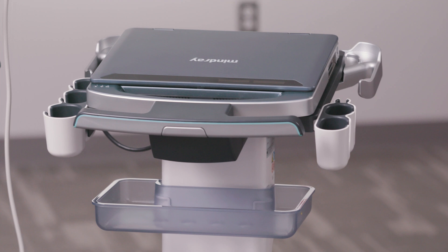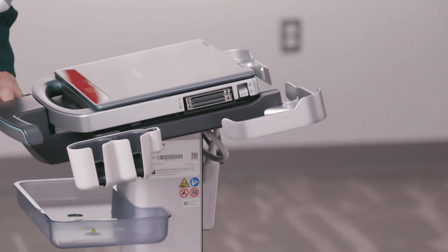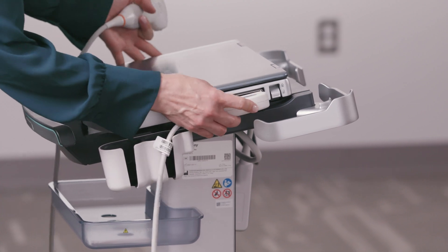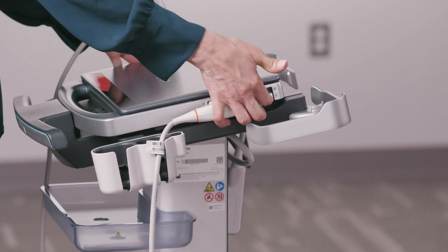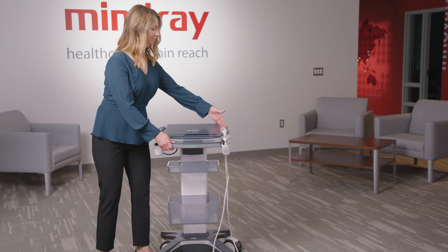Let's go over the system setup. Connect the ultrasound transducer of choice to the probe port on the right side of the system. Align the prongs with the port and lock into place with the cord facing the front of the system. If using a probe extend module, it will be connected here.